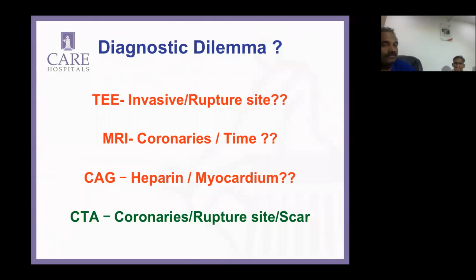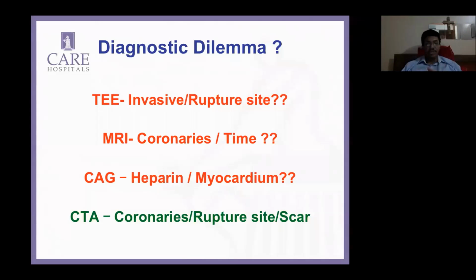Yeah. So just going ahead, I think Sharath really hit the nail on the head. Myocardial rupture or a contained rupture is something that we really need to look at in this subset. I told you I've been studying this group fairly closely. The options generally available to most of us would be a TEE first. Remember, it is semi-invasive. The patient is having ongoing pain and is obviously a little distressed.